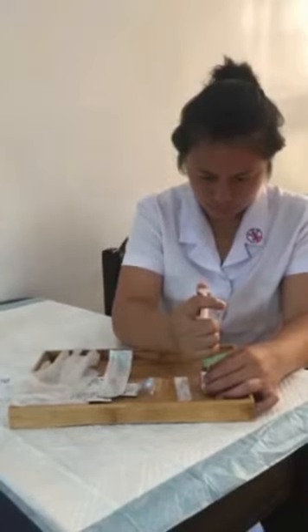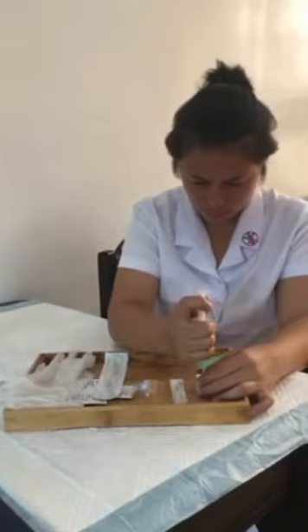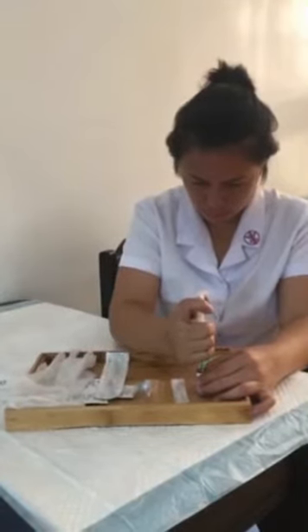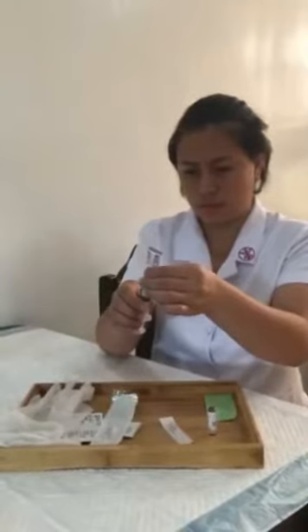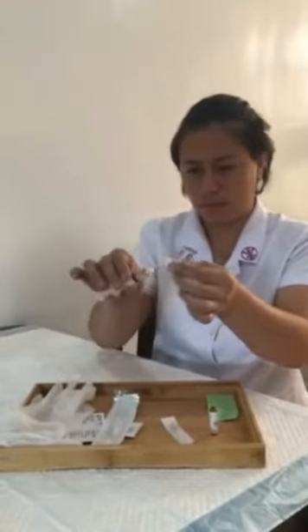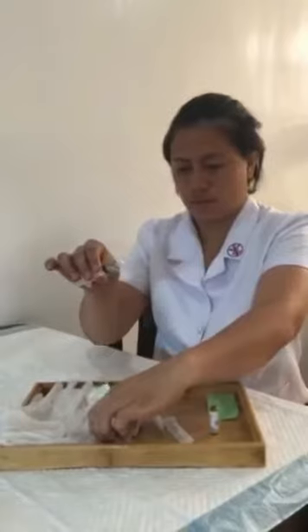With a single dose ampule, hold the ampule slightly on its side if necessary to obtain more than the ordered amount of medication. Dispose of the filter needle by placing it in the sharps container. If giving an injection, replace the filter needle with a regular needle. Tighten the cap at the hub of the needle and push solution out of the needle to the prescribed amount.